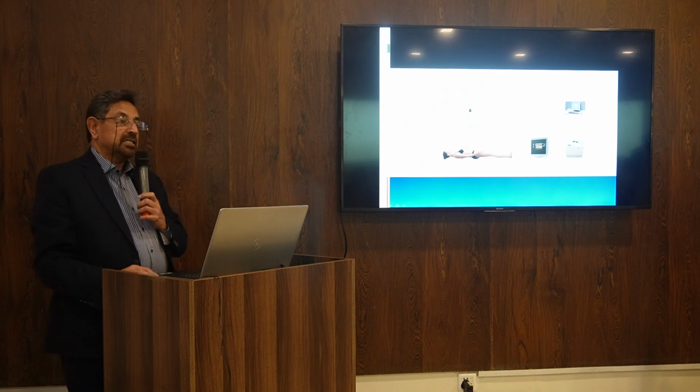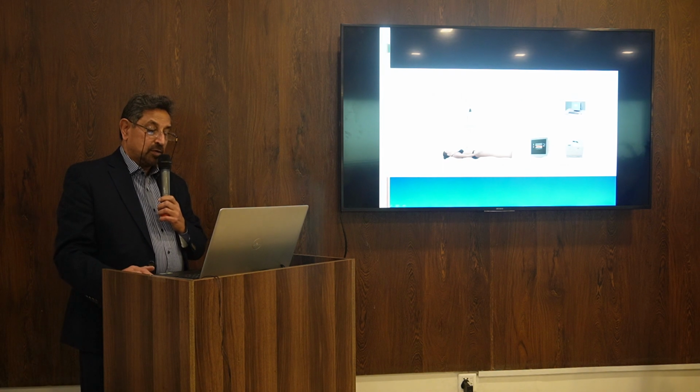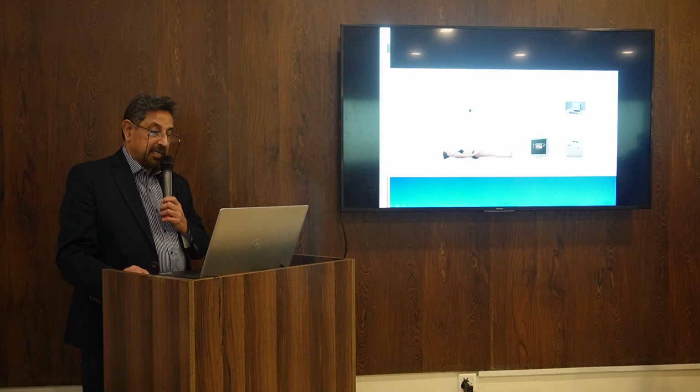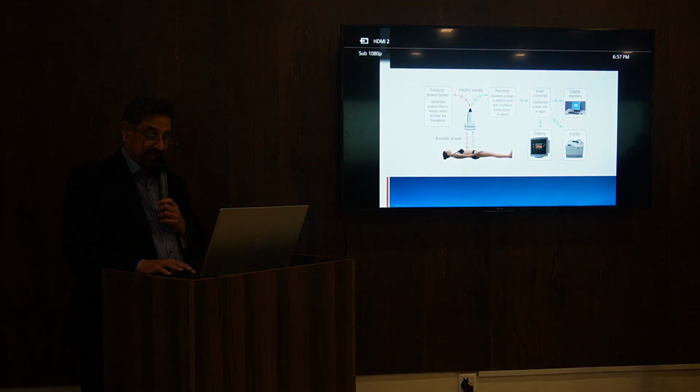So ultrasound started with A mode and graphic representation. Then with the advent of new techniques, new machines, we send electrical impulses to this transducer having piezoelectric crystals. Electrical energy is converted into sound waves, goes into the body, comes back, goes to the machine receiver, then the scan converter, and the image is seen on the ultrasound machine. And we can save the image in the machine's memory or get a printout. That is the whole procedure.